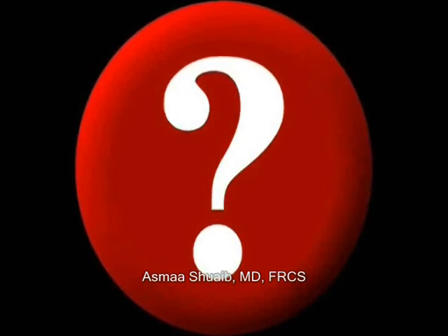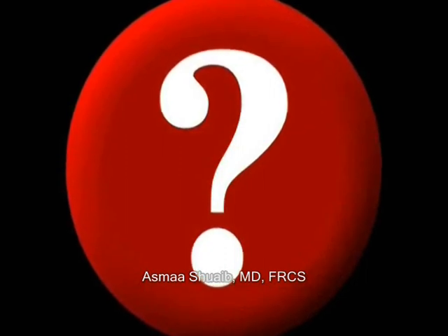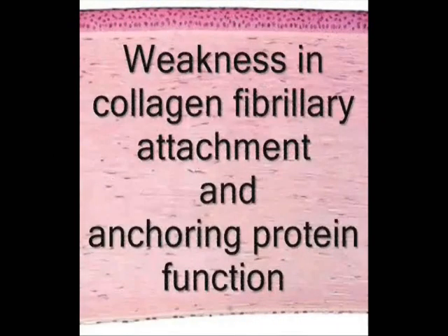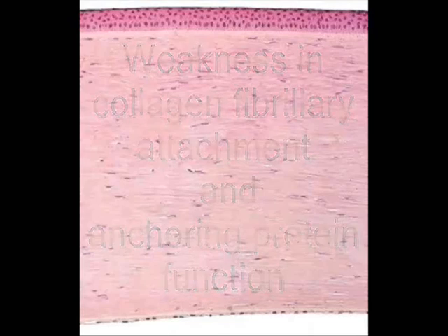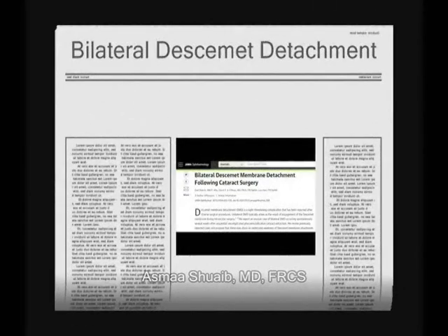Our patient was lucky with a happy ending, but she made me think about the cause of recurrent Descemet detachment on trivial surgical trauma in the same eye. Most probably, this is related to the presence of an underlying weakness in collagen fibrillary attachment and anchoring protein function that can only be determined through histological examination, although specular microscopy and anterior segment OCT were helpful. This claim is supported by the previously reported cases of bilateral and delayed onset Descemet detachment post-cataract surgery.